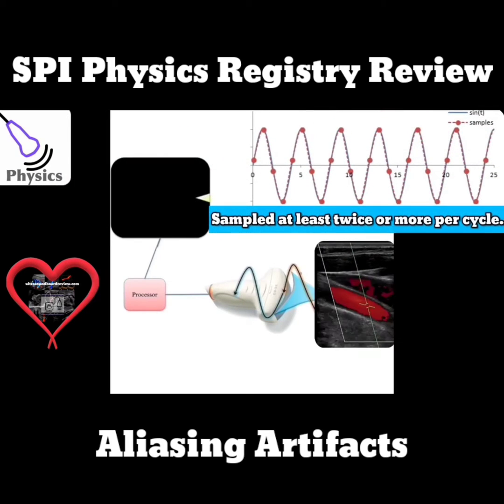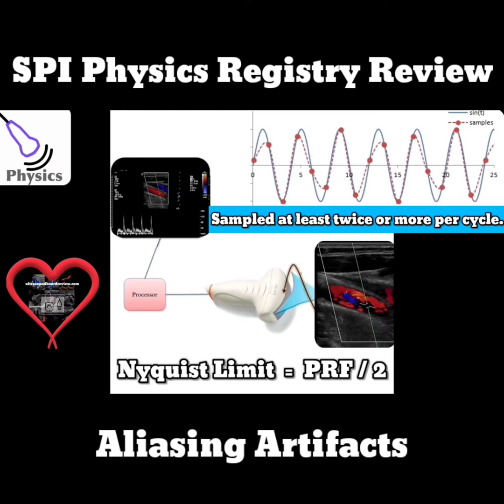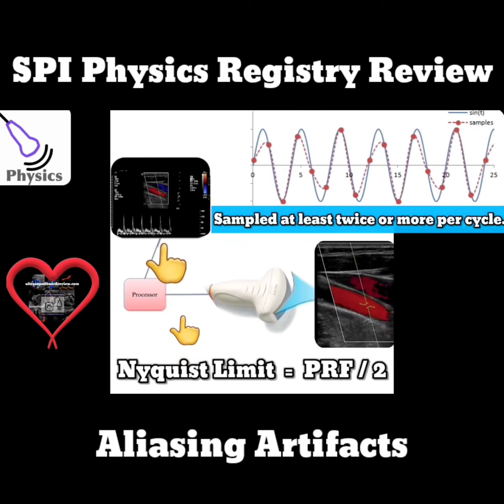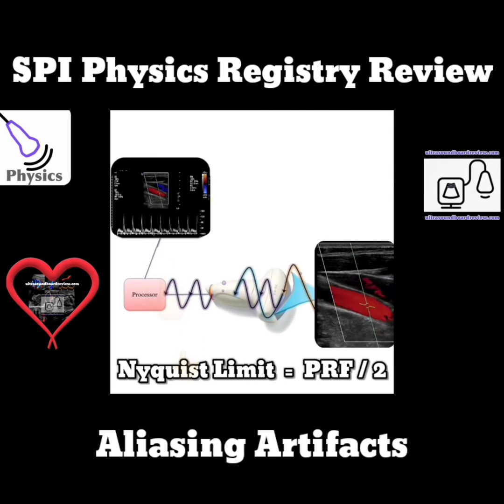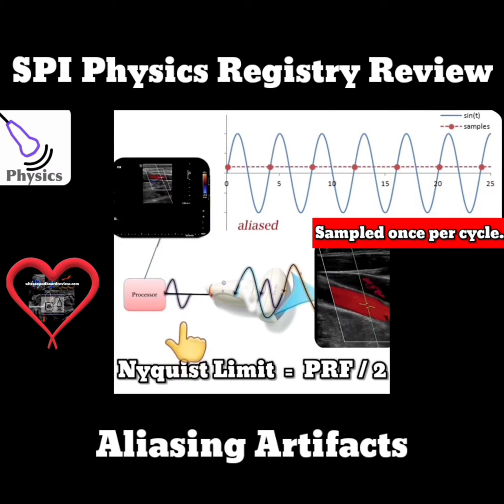Doppler velocity is accurately measured when each area is sampled twice. This is what the number 2 means in the Nyquist limit equation. In this diagram, the two purple waveforms represent two Doppler samples that display an accurate spectral velocity measurement on the screen. In this diagram, the smaller purple waveform represents a single Doppler sample.